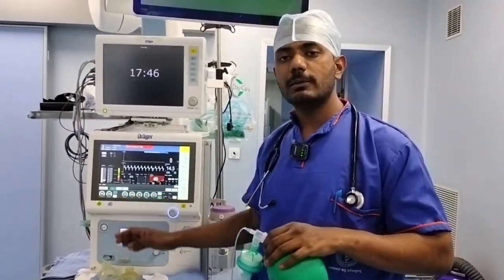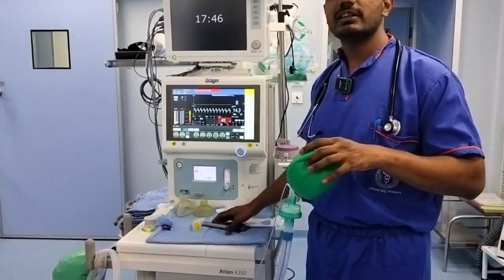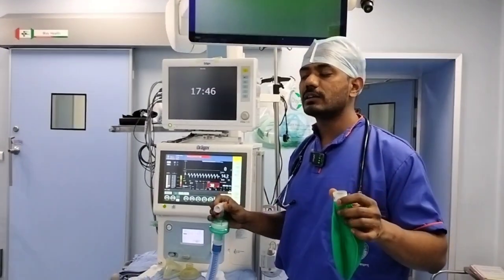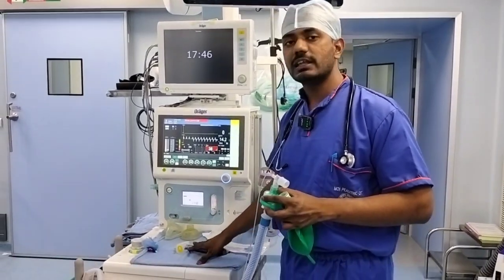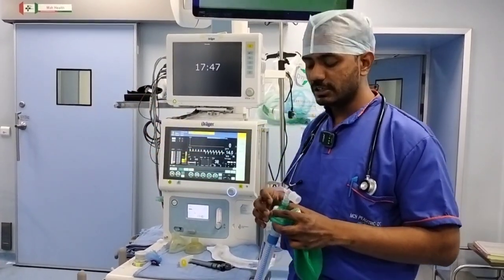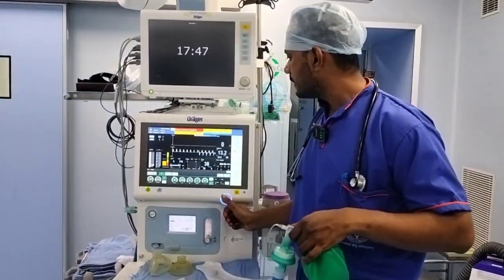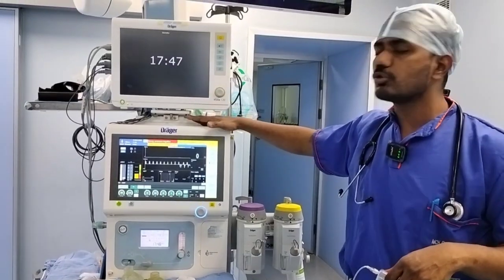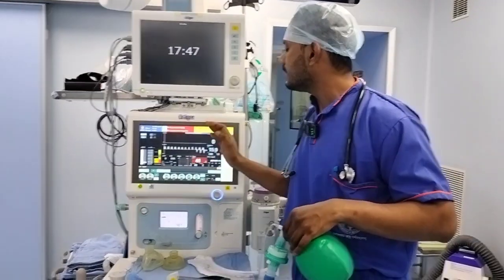Before putting the patient on the ventilator, we usually test whether the ventilator is working properly with the help of the test lung, because once we connect it to the patient, we will never know whether the problem is due to some dysfunction in the ventilator or in the patient's lungs. The next thing is the respiratory rate. Many alarms are coming while I am demonstrating this, because these are usually called safety alarms.